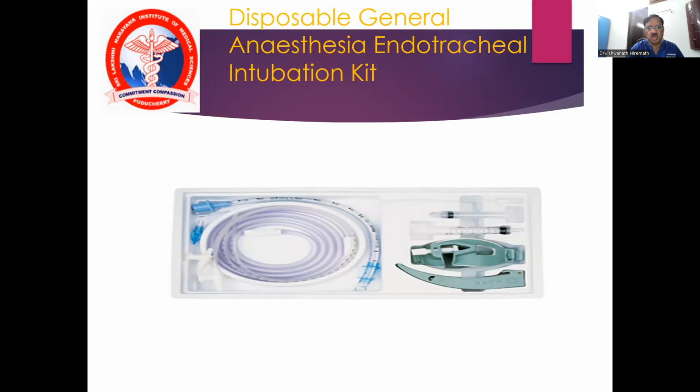So the kit should contain all the things that are required, like endotracheal tube, laryngoscope, adhesive tape, syringe, apart from the equipments I mentioned previously.